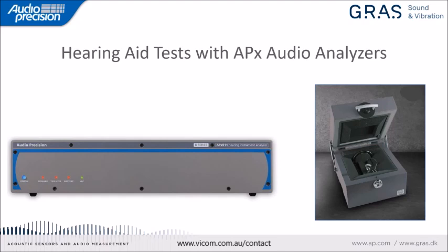Great, thank you, Paige, and thanks to everyone for attending today. Before we get started, I just wanted to point out that on most of the slides you'll see the Audio Precision logo and the GRAS Sound and Vibration logo. As many of you know by now, we've merged. We're both separate companies, but owned by the same parent company, and we have started to consolidate some of our functions. Those functions include technical support, which I'm a part of, sales and marketing. So I'm now part of a global technical support team. We have offices here in the USA, as well as in Europe, the UK, and a couple of offices in China as well.